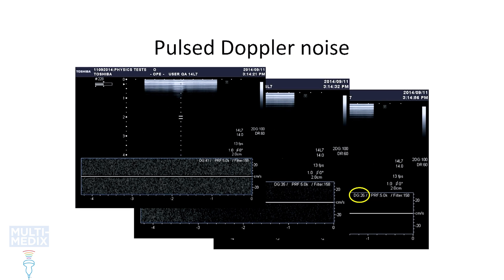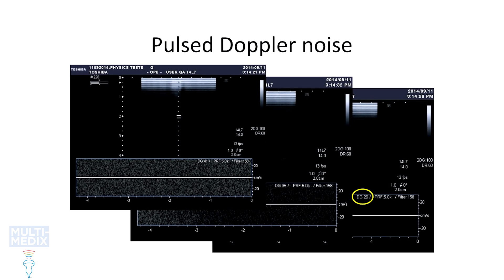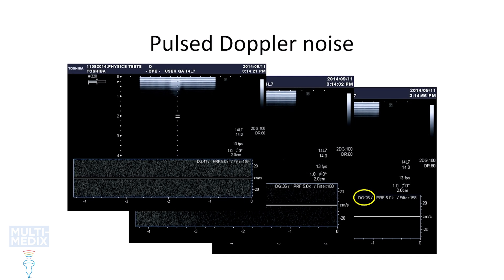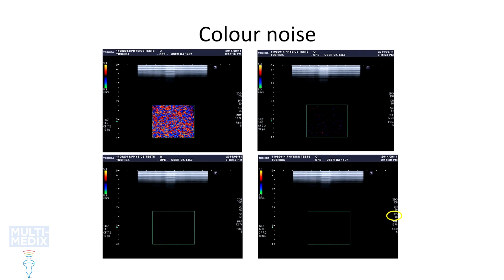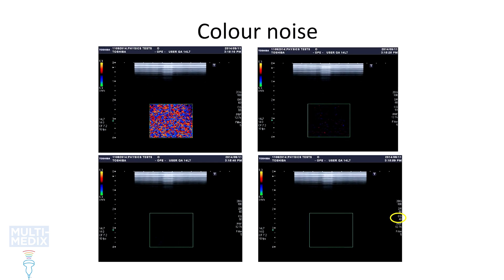As pulsed and colour Doppler are processed in separate channels to B mode, we need separate noise thresholds. For pulsed Doppler this is done with the range gate centrally, and for colour with the colour box at the bottom of the image for consistency. Then the gain is increased to see noise and reduced again until the noise is just eliminated.